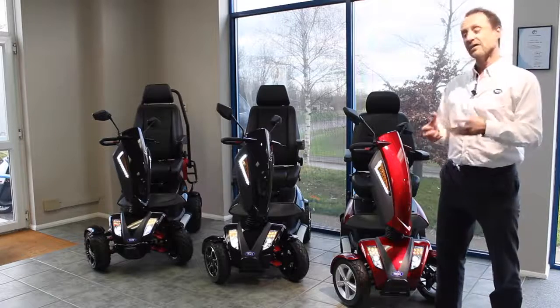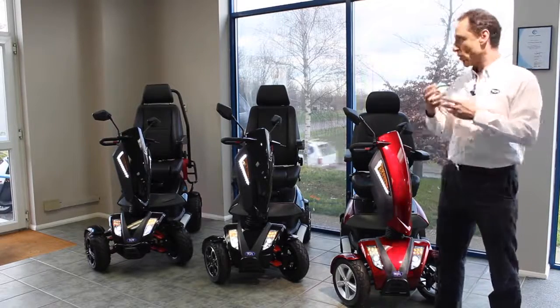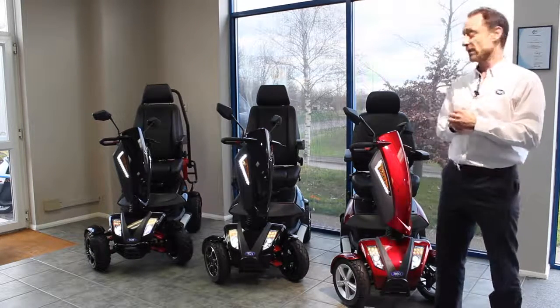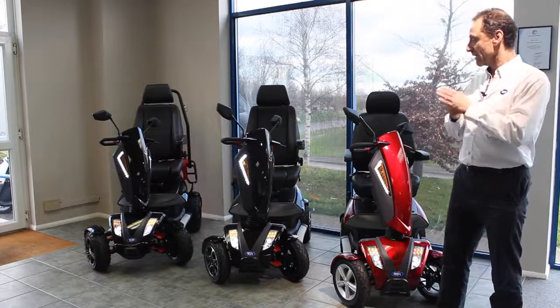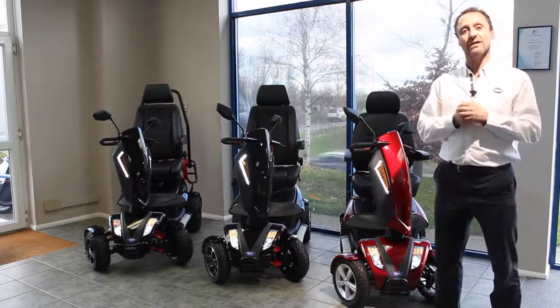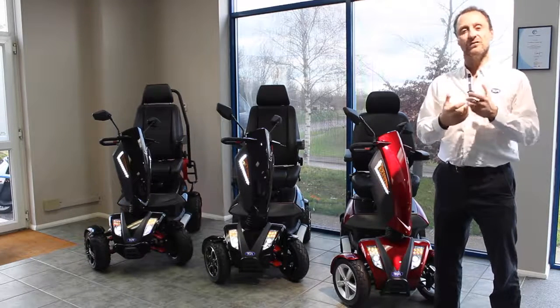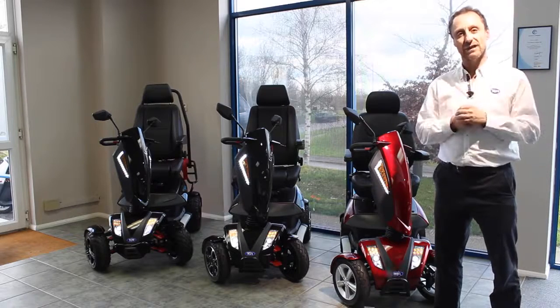The most important thing, the fundamental aspect of the Vita range of products is about the design. It's about getting a product that looks really stylish. We feel it's one of the best looking scooters on the mobility market and that was really at the forefront of everything behind it. We want you to end up with a really good looking product, something that you feel proud of, something you're happy going out and about with — and that's really key.